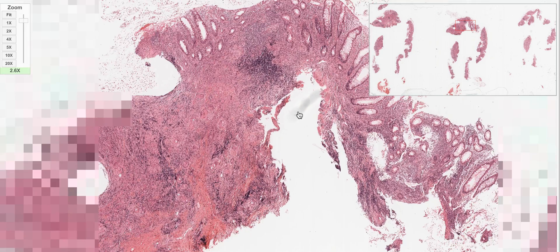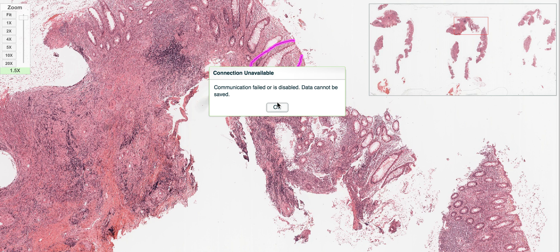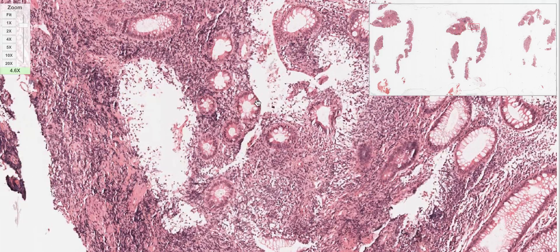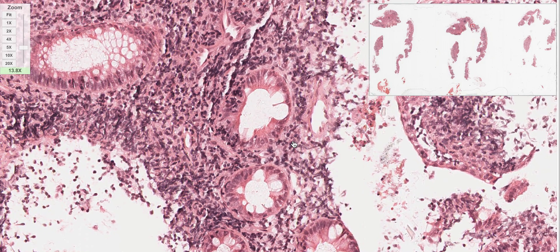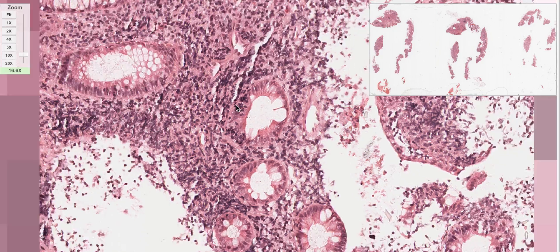The first finding I'm going to show you is a crypt - whatever goes down below is called a crypt. When cutting a crypt in cross-section, it looks like a ring. I'm zooming into a crypt now. What is abnormal with this crypt is: first, it's not exactly round - it's distorted. And you can see a few cells which are coming in and trying to destroy the crypt. These are inflammatory cells. I call this finding cryptitis - that is, inflammation of the crypt.